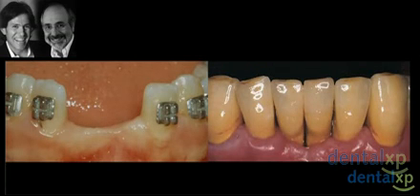And what we saw in the previous case, obviously this is not a case that is not functional. We have 2 implants that have osseointegrated. This was a cover article in the Journal of Prosthetic Dentistry. Beautiful ceramics, root form, and certainly nice color, but the issue is really the aesthetics of this environment. And then of course for me as a periodontist, David, I have to tell you the long-term management of this area as a cleansable area becomes quite uncomfortable for me.